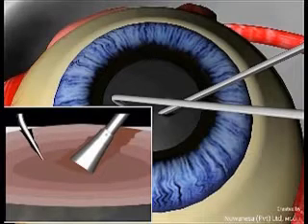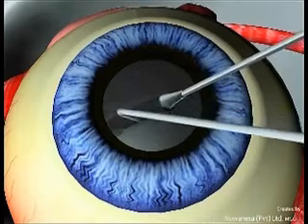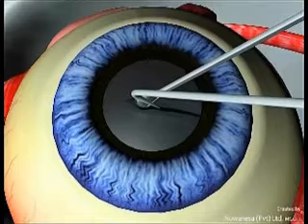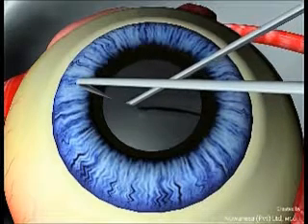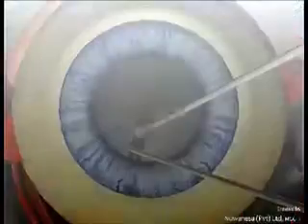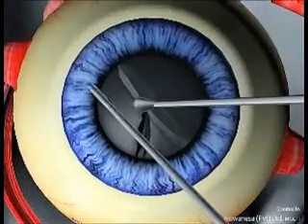Engage the phaco probe from the vertical edge of the hole and perform the vertical chop to make two halves of the nucleus. Rotate the nucleus and engage the phaco probe at the opposite edge and repeat the vertical chop to make sure you make two halves of the nucleus.